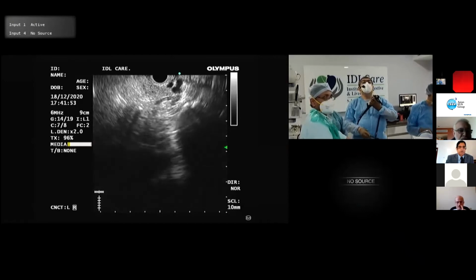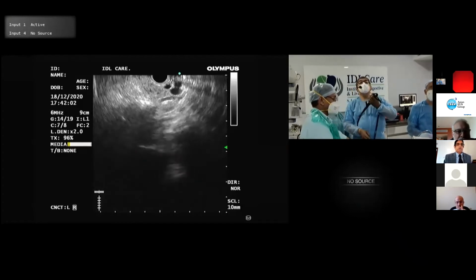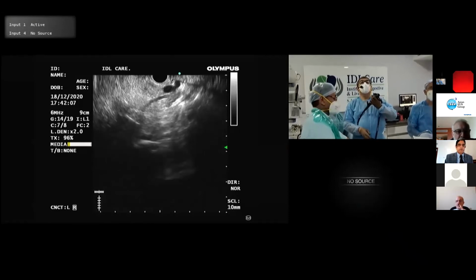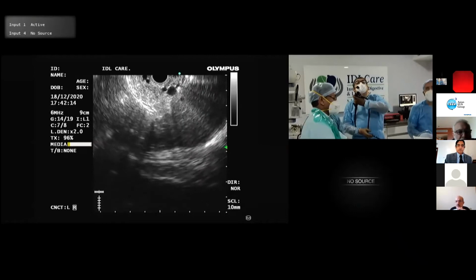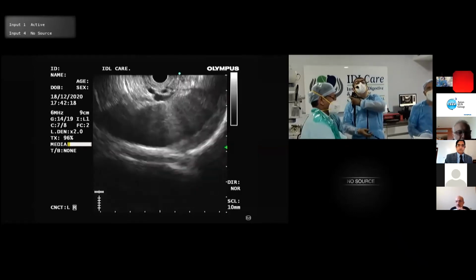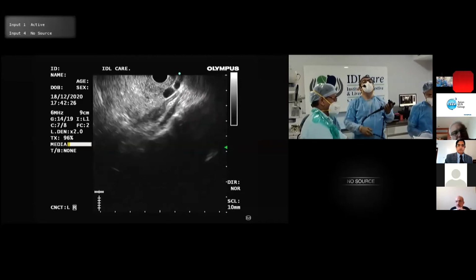So this is the left adrenal. You can see this bird-like structure here. Seagulls. More clockwise. See this? This is the left adrenal. More clockwise, more gentle withdrawal, keep tracing the tail, and you are coming to the splenic hilum. See this? This is the splenic hilum. So the pancreas is perfectly normal, and you have this mass.